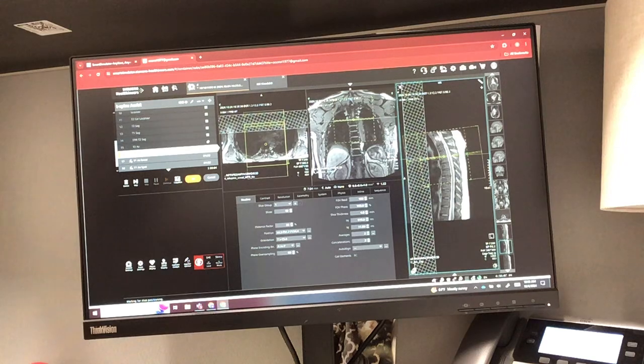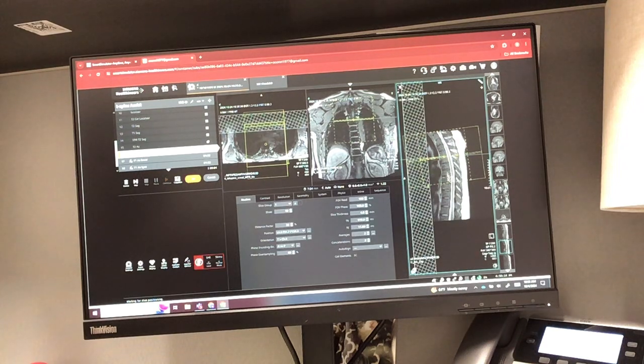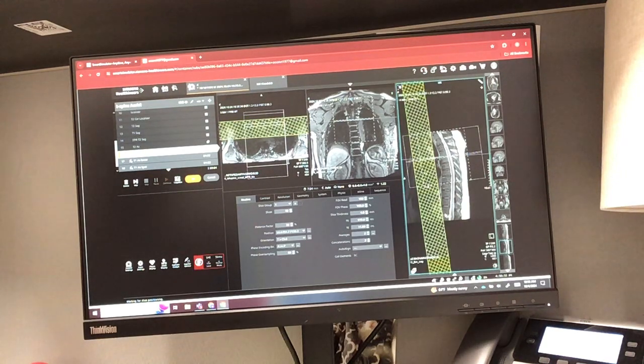Okay, so here's all of my T1 vertebrae. I'm not cutting out the C7 T1 disc space. So I have T1, 2, 3, 4, 5, 6, 7, and I have almost completely all of 8. I'm going to bring this anterior rest slab in. This is going to help with a lot of that chest heart motion that's going on, because my phase is coming in from A to P.